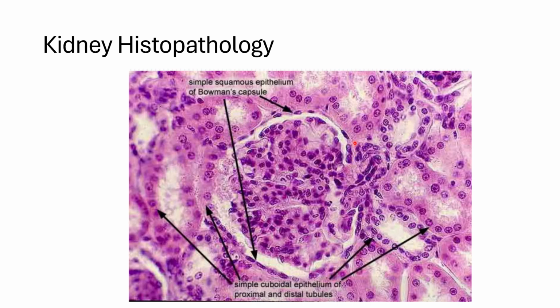It is lined by the squamous epithelium. And then we have the tubules. These are the distal tubule and this one is a proximal tubule. In future slides, we'll know how to differentiate the PCT from the DCT. So these tubules are lined by simple cuboidal epithelium.